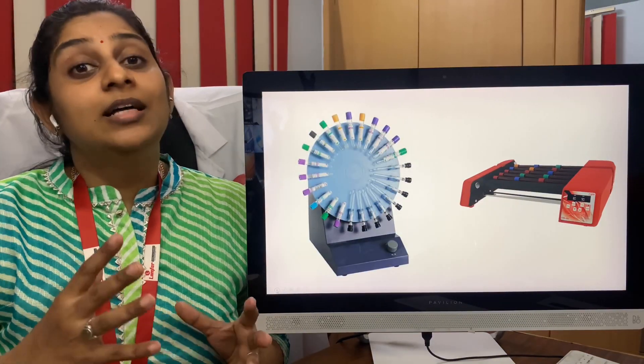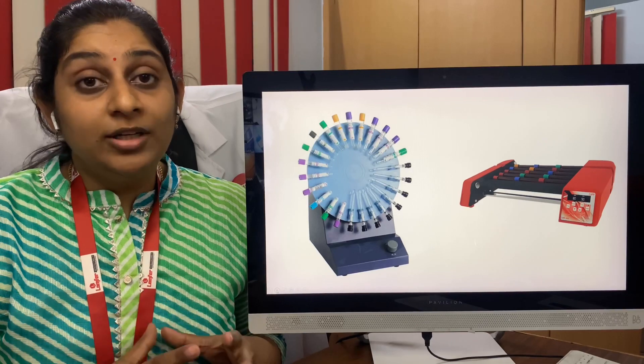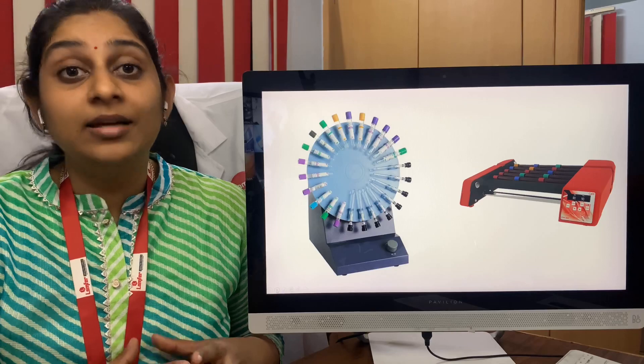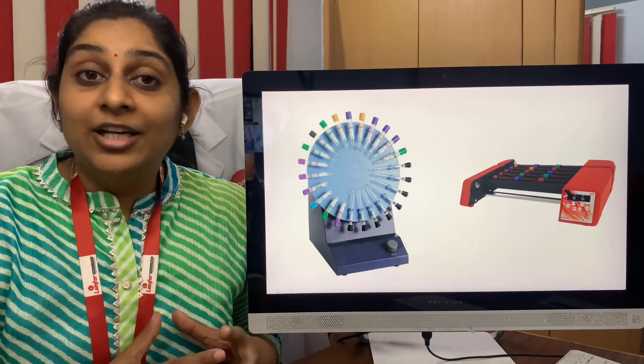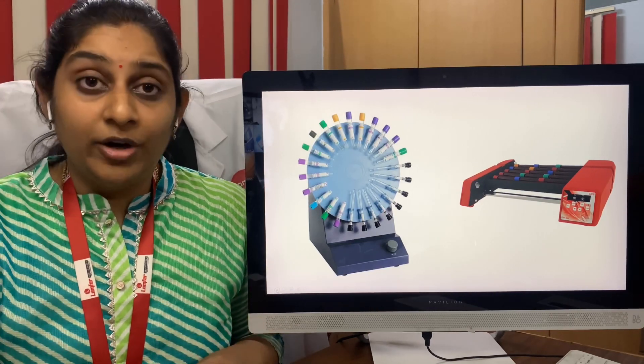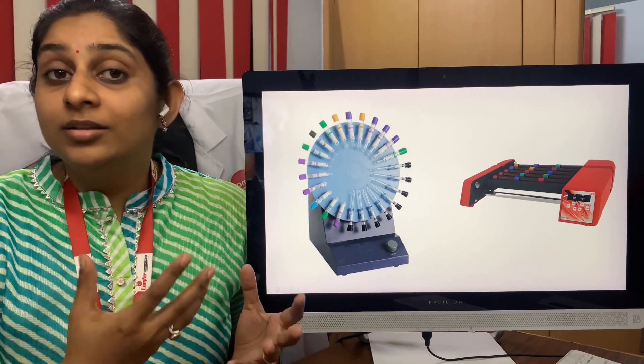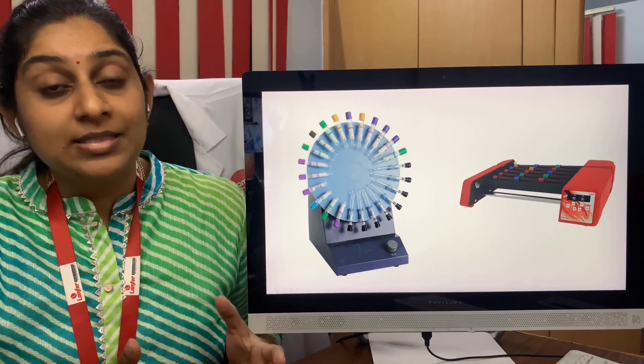Now comes the blood mixer. The blood mixer is one of the important components, very similar to the centrifuge. You need to have a blood mixer even starting from the collection center to the large-sized laboratory. You can have a vertical blood mixer or a horizontal blood mixer, as you can see in the picture.